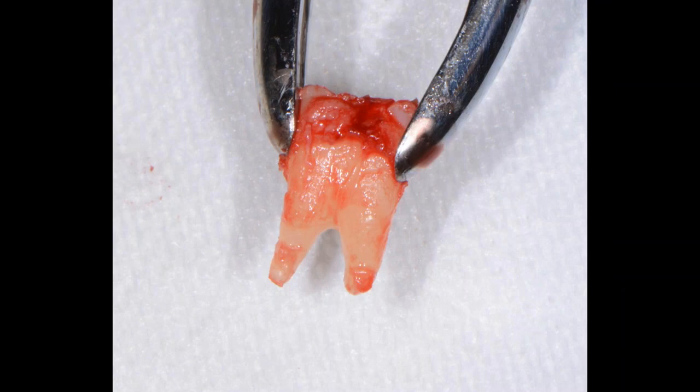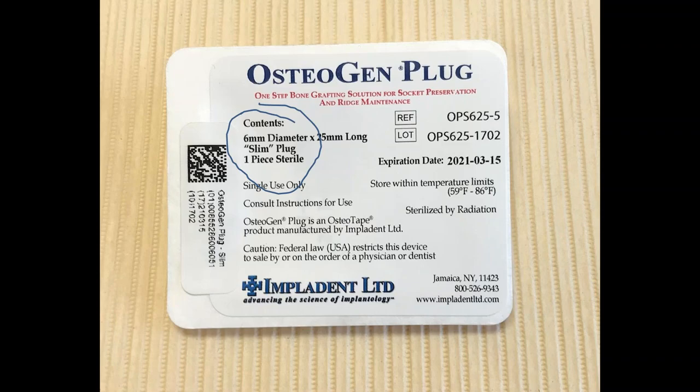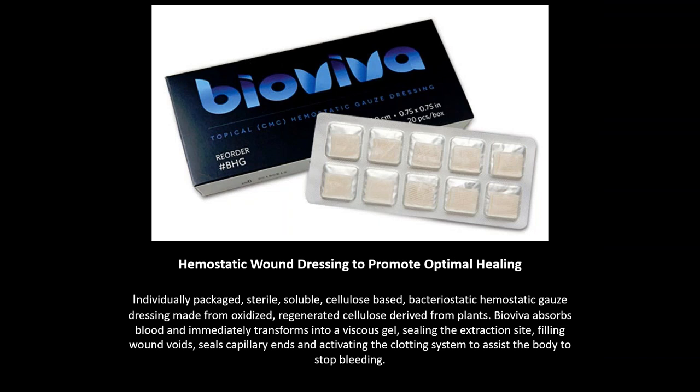So this is actually the premolar that we're able to remove as one utilizing the physics forceps. We're going to place the osteogen plug into that area. And for my wisdom tooth areas, I like to use a product called BioViva, also from GoldenDent. These are individually packaged sterile, cellulose-based, bacteriostatic gauze. But this gauze is fully resorbable. So it's a cellulose-based or plant-based material that's got a hemostatic and bacteriostatic agent in it.